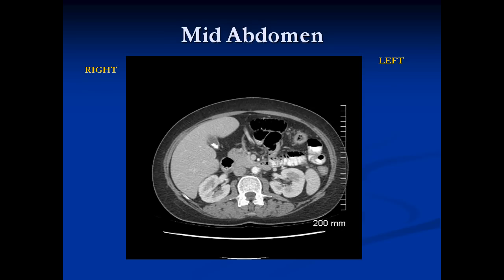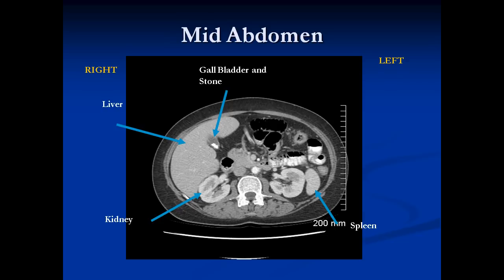Going down a little further in the abdomen, we see other structures. We can see the liver again, and now we notice the kidneys because we're lower down. The kidneys are bilateral, and the cortices and medulla are well-defined when we give IV contrast. This is the spleen. We have the gallbladder here, and there are calcifications within it — the black part is the gallbladder with bile, and the very white part is the stone. We have the head of the pancreas sitting just to the right of the midline, and here we have contrast in loops of small bowel.